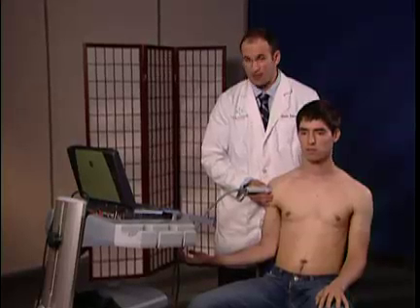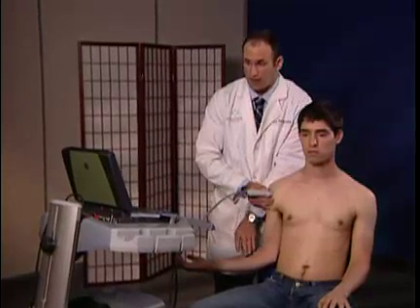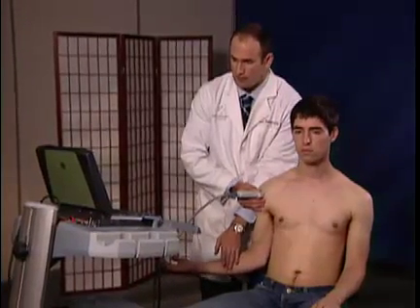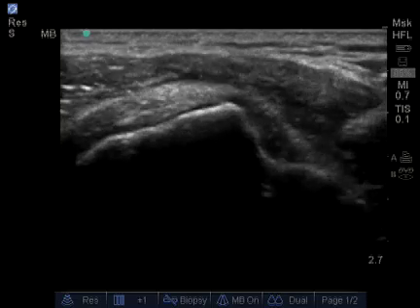Oftentimes I'll have the patient resist against my hand in internal rotation to detect any pathology. Push against my hand. Good. Relax. And again. Relax.